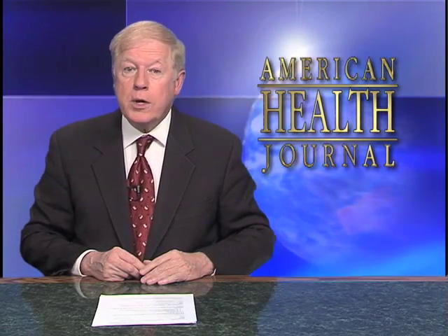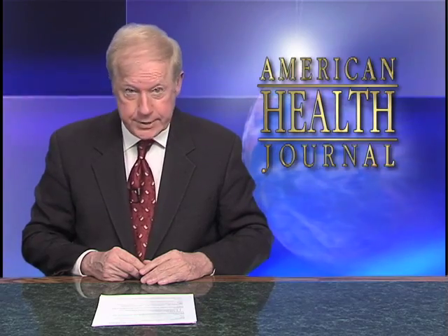We go now to our reporter Laura Windsor, who has a report on what are called cooling blankets. For every 1,000 babies born, 1 or 2 will have brain injury because of lack of oxygen during the delivery. Placing the infant into a cooling blanket quickly reduces their body temperature to allow for healing.